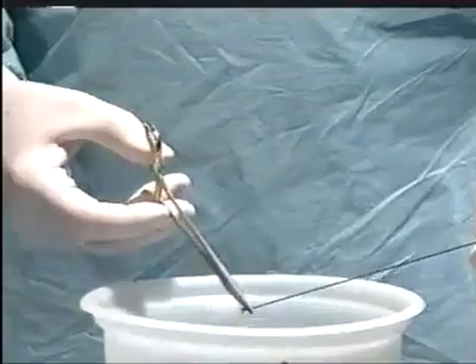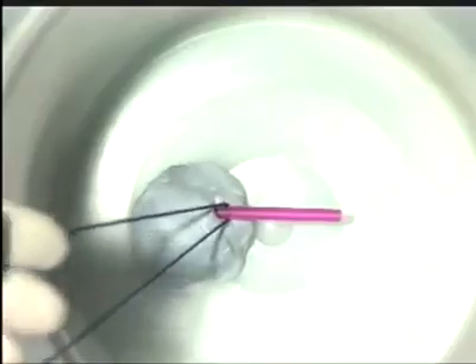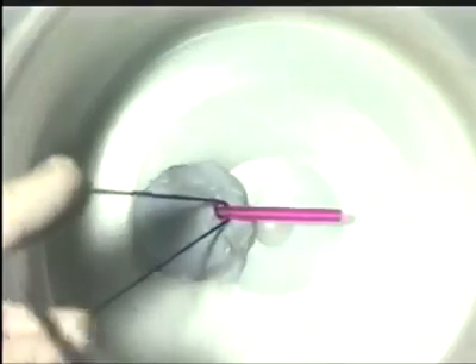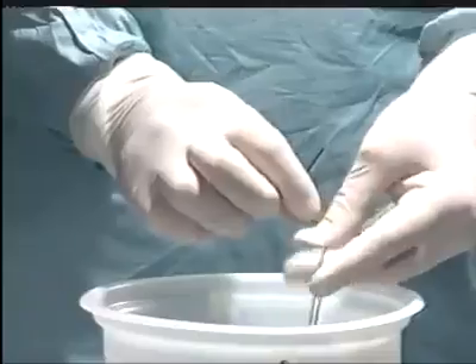Take your suture material in the tip of a hemostat and pass it round the blood vessel, taking great care not to exert any tension. Bring the suture material out of the pelvis.